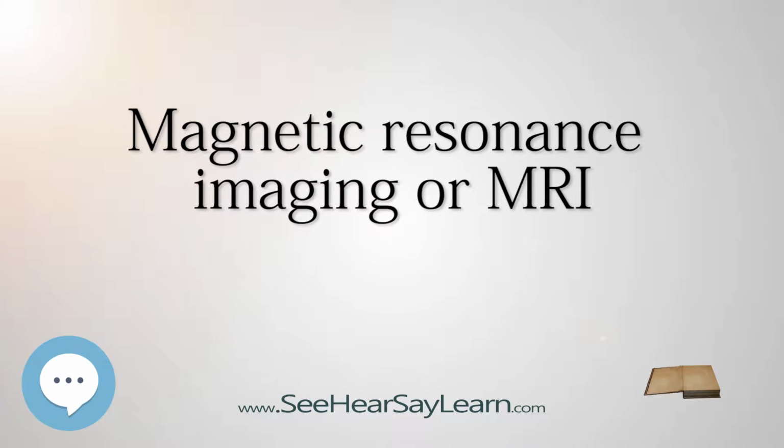Clinical magnetic resonance imaging, clinical MRI, is an imaging technique used in radiology to form pictures of the anatomy and the physiological processes of the body in both health and disease. MRI scanners use strong magnetic fields, radio waves, and field gradients to generate images of the organs in the body.